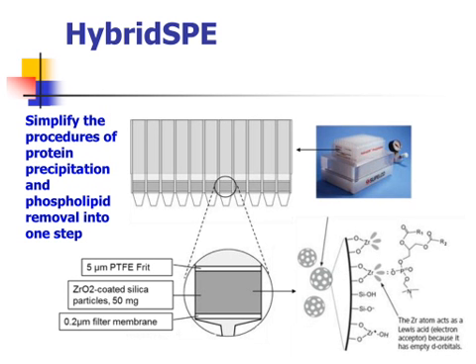Now the idea here was that if we could use a hybrid SPE to replace what we were doing with our online solid phase extraction, then we could shorten our epimer resolving method so that it would be able to replace this 2-stage process that we were using for our routine analysis. And the other benefit, obviously, is you've got a little bit more to play with your chromatography when you don't use online solid phase extraction. So you can actually speed things up a little bit.